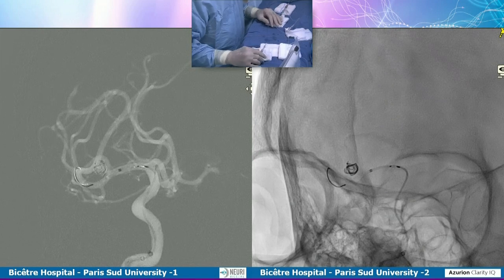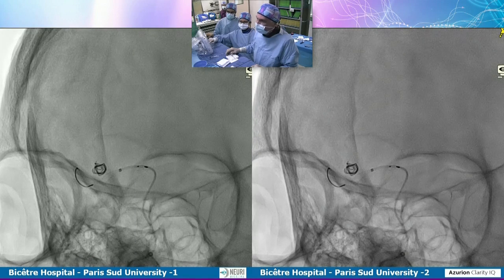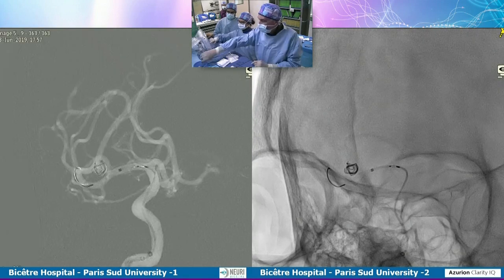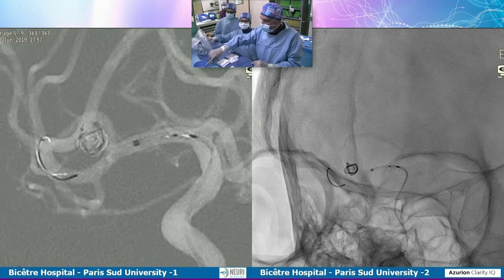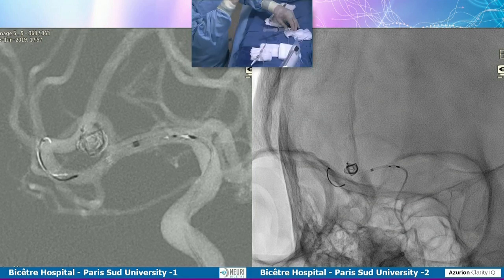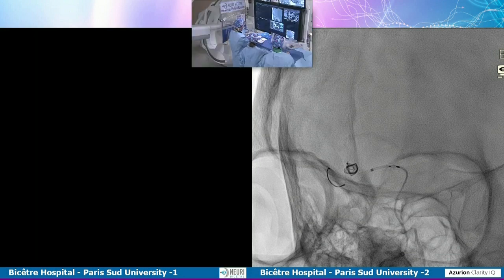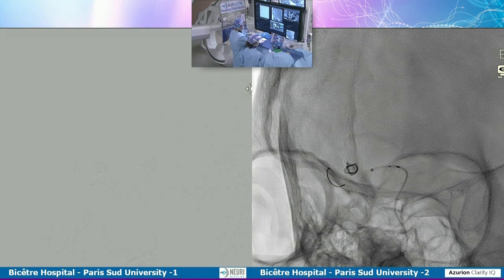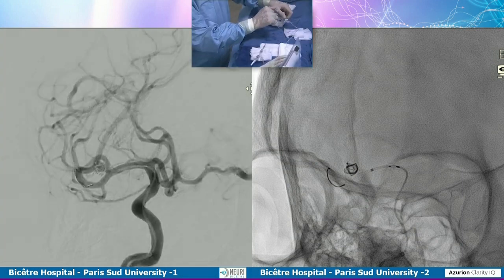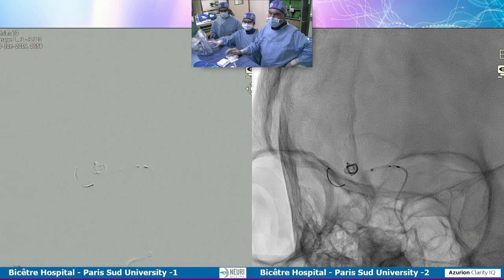Alan, what would you do? Yeah, I'm learning something about test occlusion. It's anatomical. Yeah, but I would favor clipping this aneurysm myself. You could clip both of them, the big one and the very small one. The clip will not slip. 2 clips. You're not narrowing the inferior branch. No, we have very small clips, a 1 millimeter clip on that, and then probably a fenestrated clip overlapping it on the larger aneurysm. That's one of the advantages of open surgery.